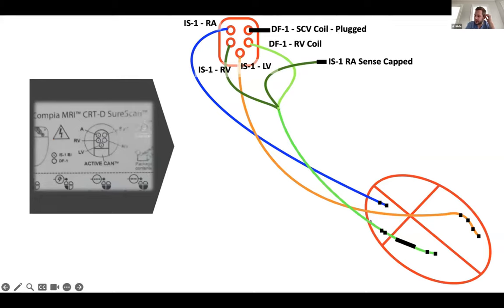You mentioned the initial lead you were having issues with. Can you elaborate exactly what was going on? I passed that initial lead through, even with the severe tricuspid regurgitation. When I tried to place it, I pointed it at multiple points. I wasn't getting a good signal with that lead. That was what happened. First, if you look at the sensing, it was not optimized at all.